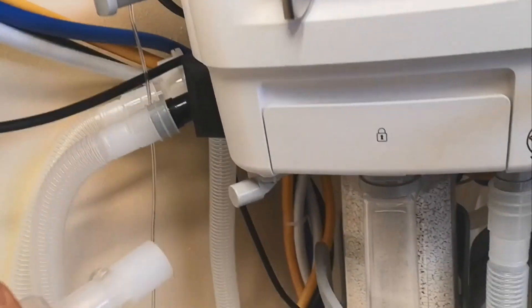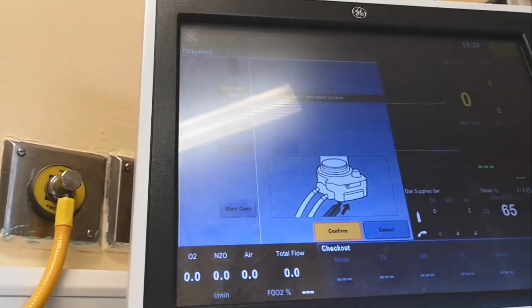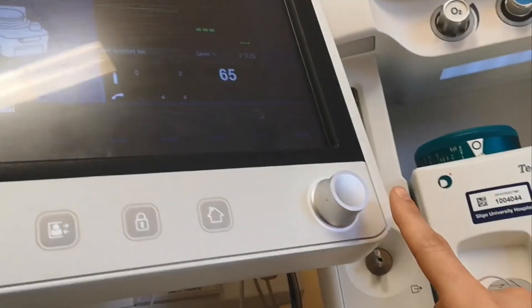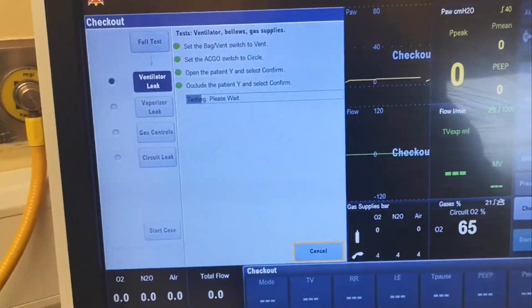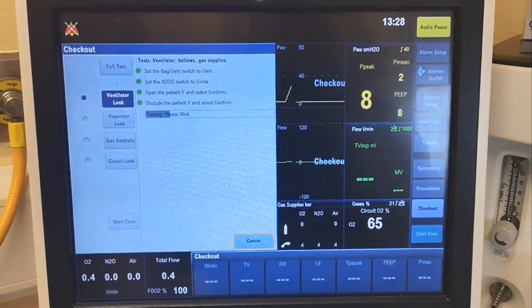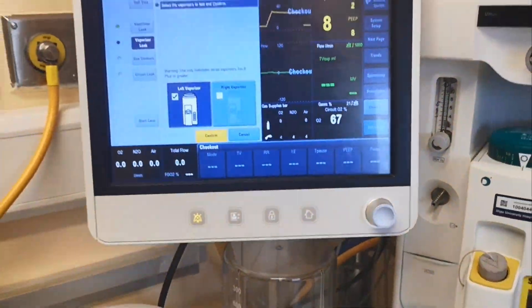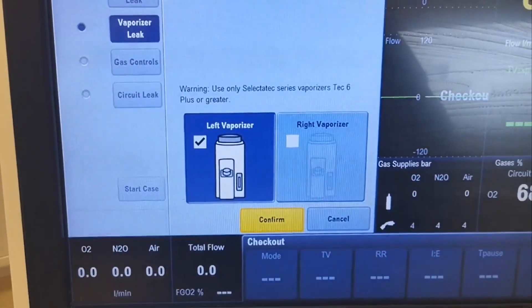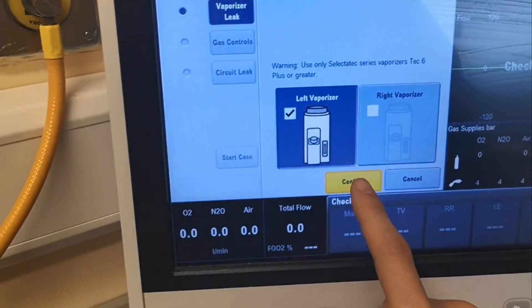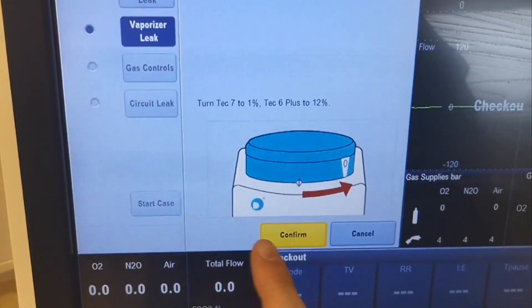Occlude the patient Y and select confirm. Take the patient Y and hook it down here, then confirm — you can press here. Now it's asking you to check the bubble of the vaporizers as well. It's on the left — confirm, turn it down, confirm. Just follow what it asks.